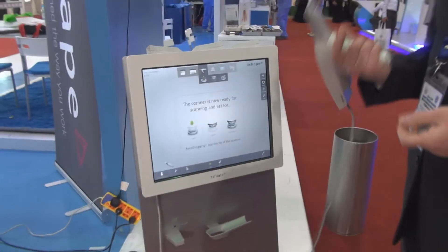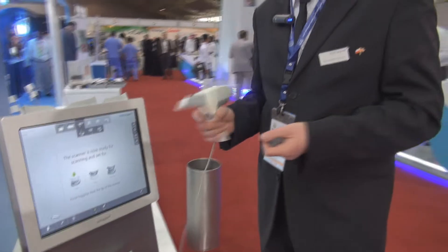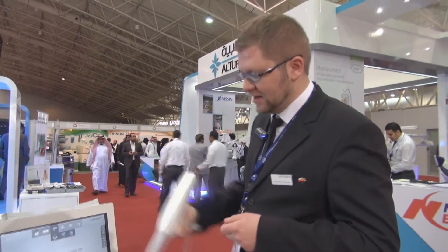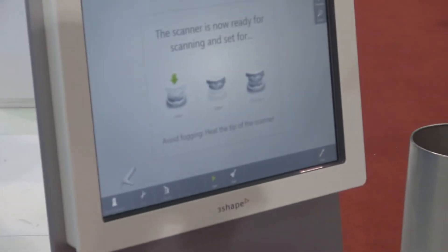I've chosen the lower model and I will try to scan some of my own teeth. As you can see, we don't have clinical conditions in here, but despite that I think we can perform some sort of scan. As you can see there's also a gyroscope, so the system knows exactly in which position the scanner is at any given time.